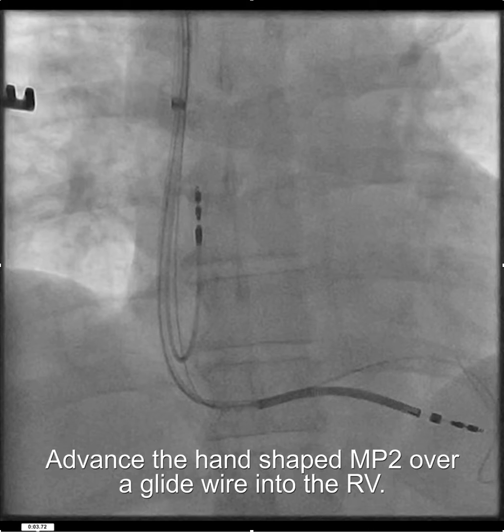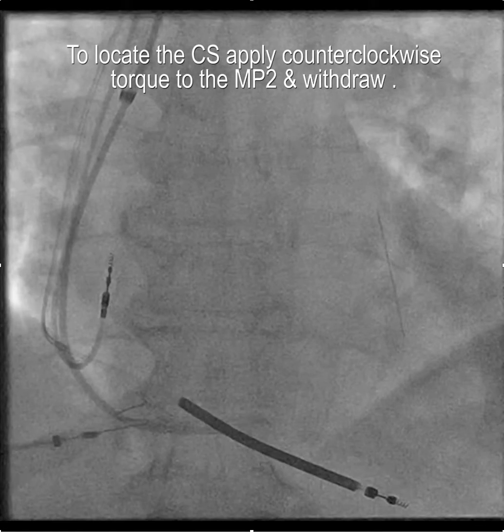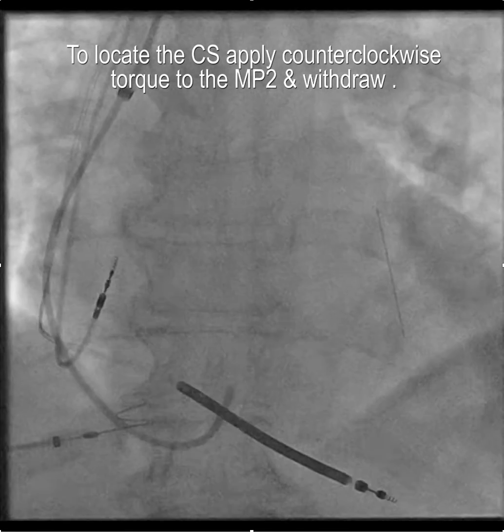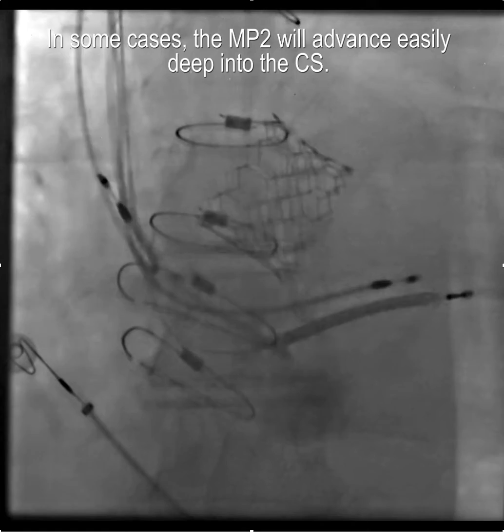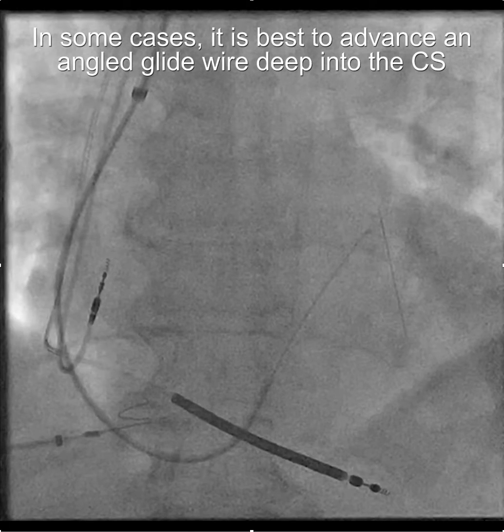What we're doing here is advancing the hand-shaped multipurpose catheter over a glide wire into the right ventricle. From there, we withdraw and apply counterclockwise torque to locate the CS, and that usually goes pretty smoothly. Once you locate the CS, in some cases the MP2 will advance quite nicely deep into the coronary sinus.